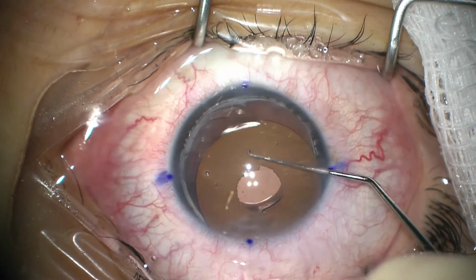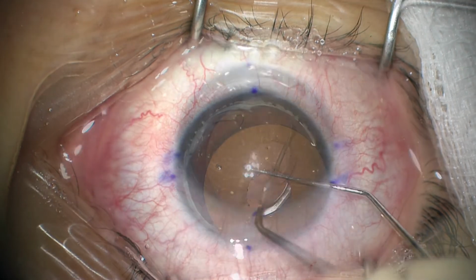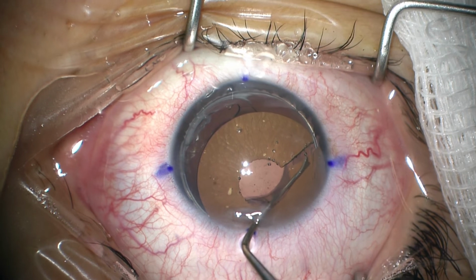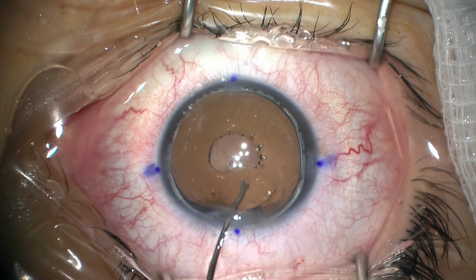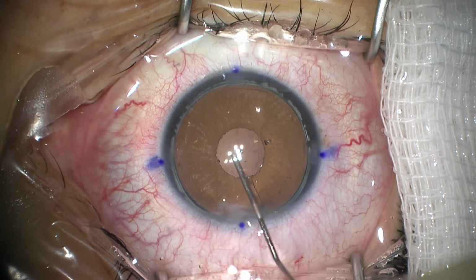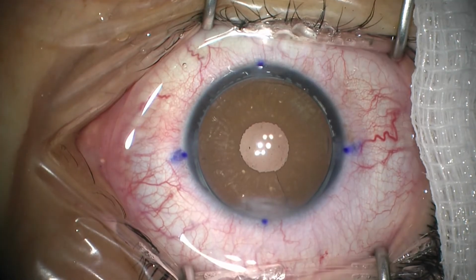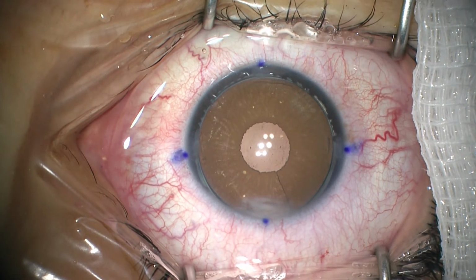Put the iris inside the capsular bag slowly, with a rotational movement similar to that performed when the capsular ring is implanted, avoiding, as far as possible, traction on the capsule or zonule. And finally, remove the viscoelastic from the anterior chamber. At the end of the surgery, the artificial iris can be seen inside the capsular bag.